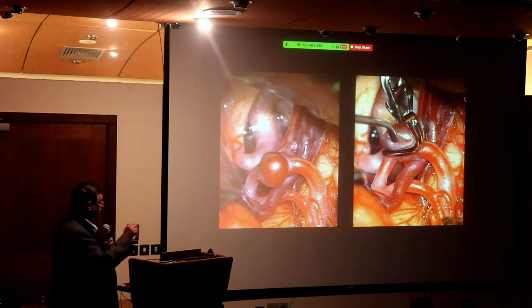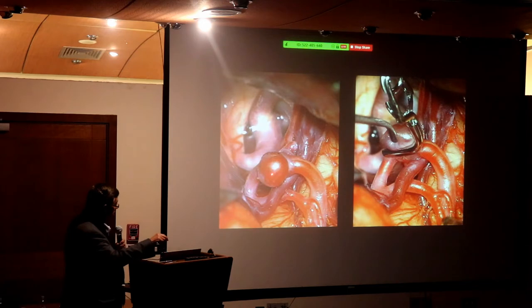It's either you or him. And you can see the fundus is very thin and it's pointing to you. I'm going to rupture it. Yeah. And you say, what brought me here?